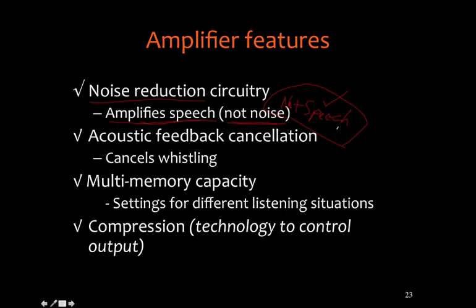Yet we can hear their speech and understand it because the microphone they're talking into, that speech processing circuit their speech is going into, mathematically knows what the steady state frequencies of that engine are, which is just right next to them, and excludes that from the amplification, excludes that from the circuit.